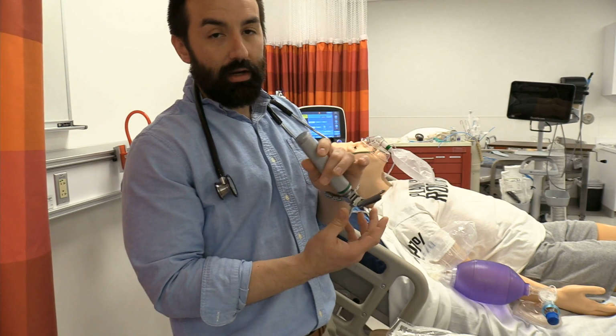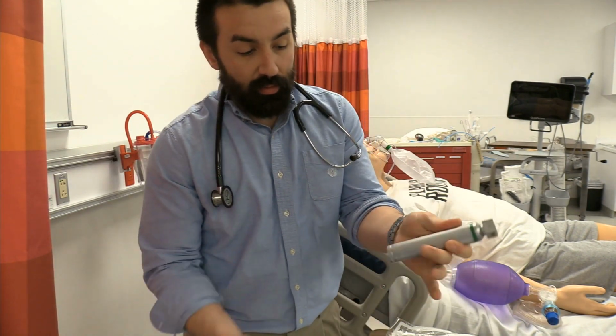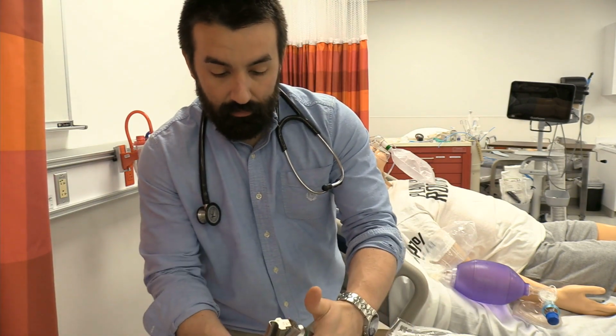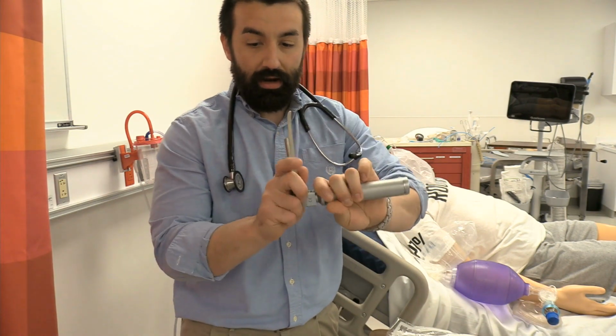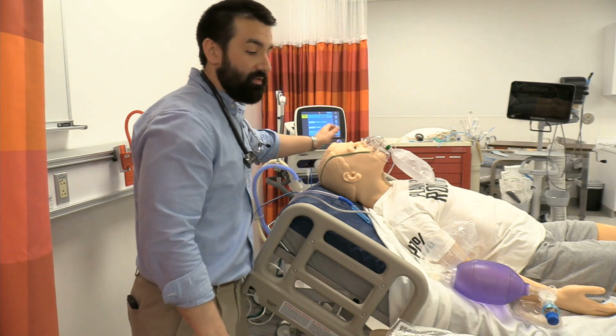I've already asked her, she wanted a Miller tube blade, so I want to go ahead on these reusable ones, make sure you got batteries in there. This piece is just going to lock down on that bar. You hear the click. Make sure you got a nice light, and then I do close it so I don't burn through everything.